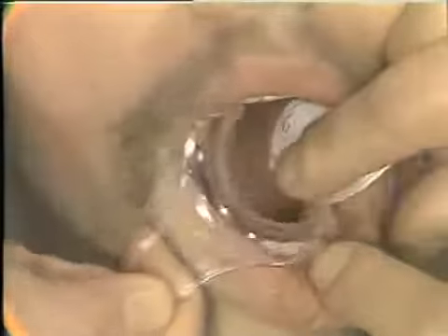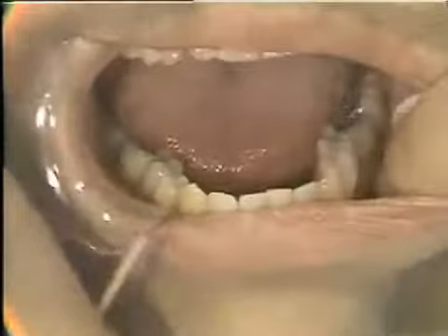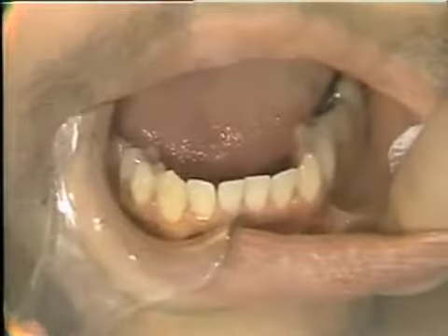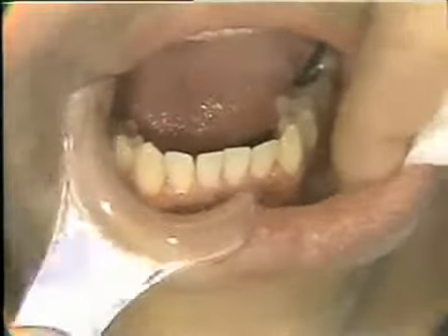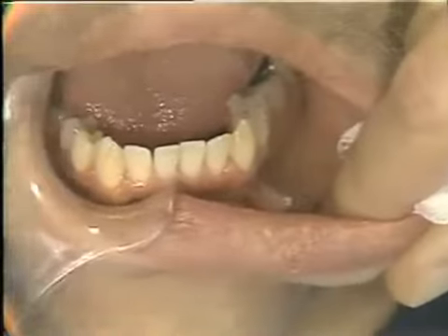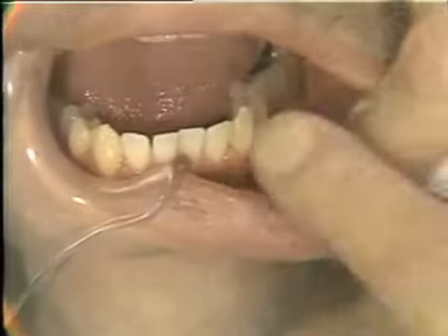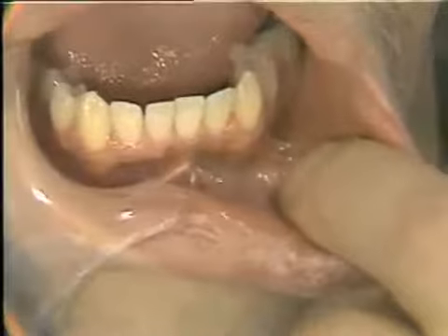All right, let us demonstrate infiltration of the lower cuspid tooth. We just have them open partially till we get our retractor placed here again to throw a little more light in here. Now, you'll notice that as I retract Andy's lip here between index finger and thumb, I retract it out and upward slightly, how these tissues become quite tense here in the vestibule. You can see that quite nicely. And if we can keep them tense, again, we can pass the needle bevel through them with literally no discomfort.